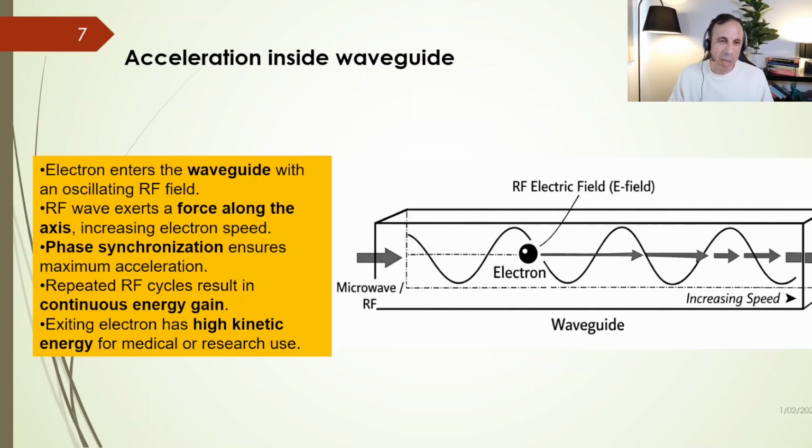It is very similar to a traveling one, not the standing one, but it is a simple way to understand how the radio frequency wave can affect the electrons, push them forward and give its energy to electrons. Electrons are accelerated by radio frequency waves. It doesn't matter whether it is standing or traveling.